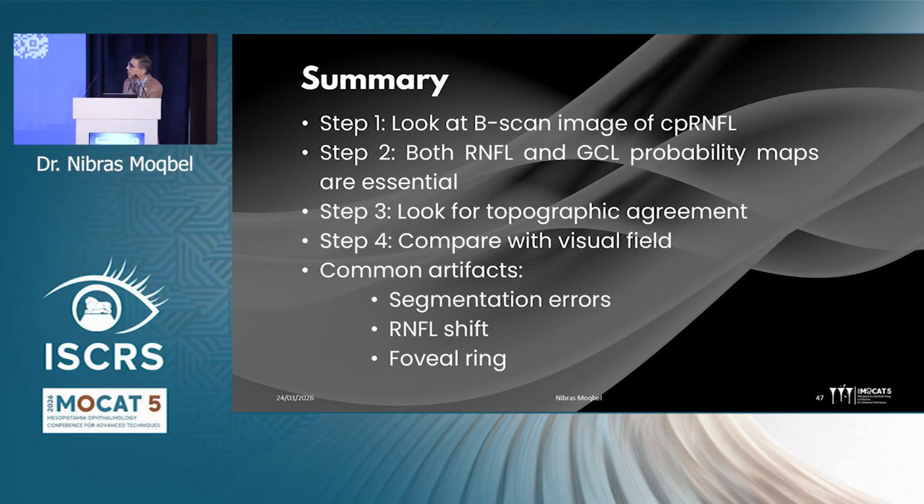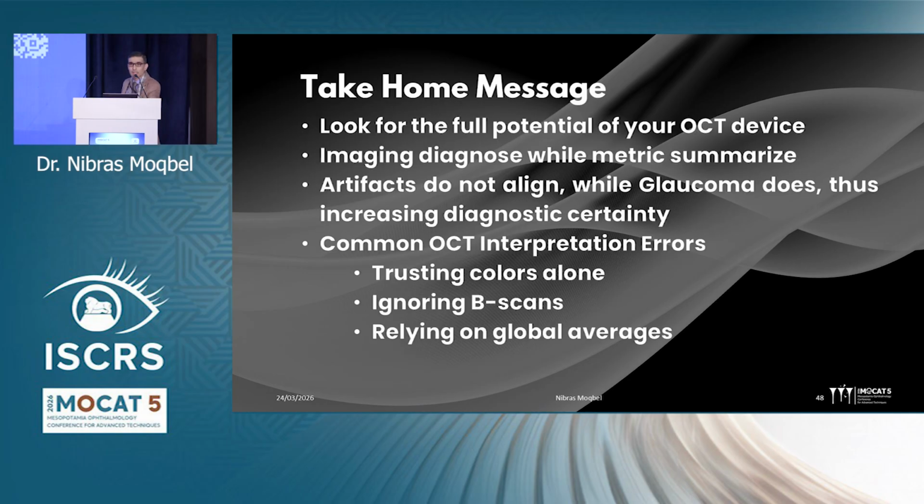What are the take-home messages? First, look at your OCT device and try to get the full potential of it. Don't rely on the report that you usually receive, and that's it. Remember that imaging diagnoses while metrics summarize. Don't rely on metrics to diagnose.